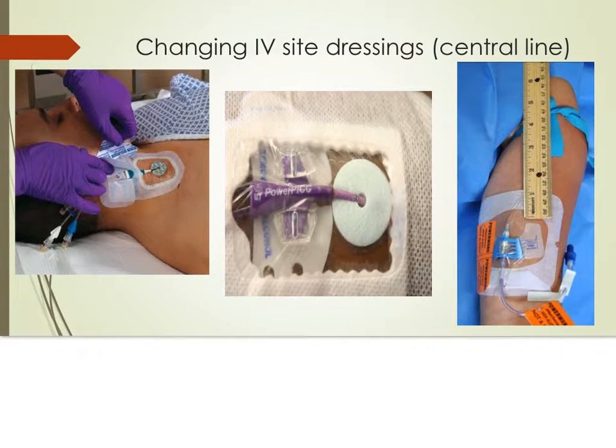Remove gloves and dispose. Perform hand hygiene. Do not lose sight of the catheter insertion site. Next, apply sterile gloves. Clean the site thoroughly using the ChloraPrep or other cleanser provided in the kit. Use repeated back and forth strokes of the sponge to clean the site.